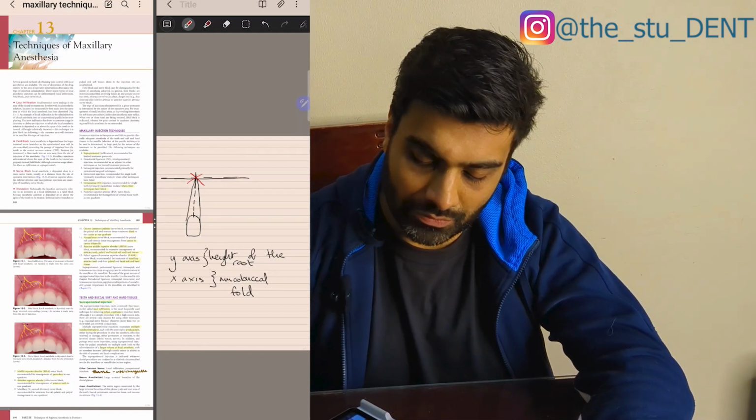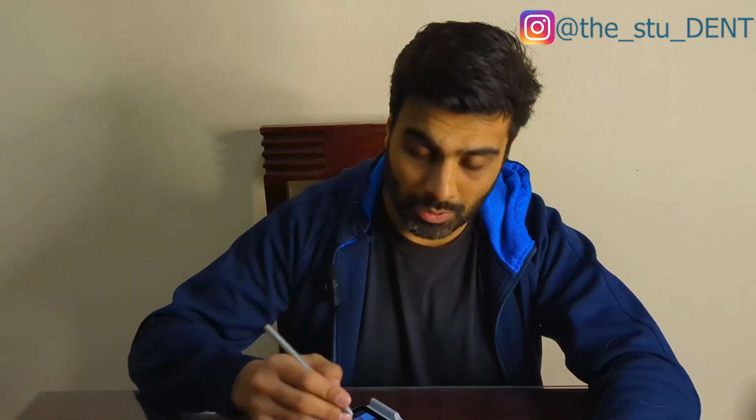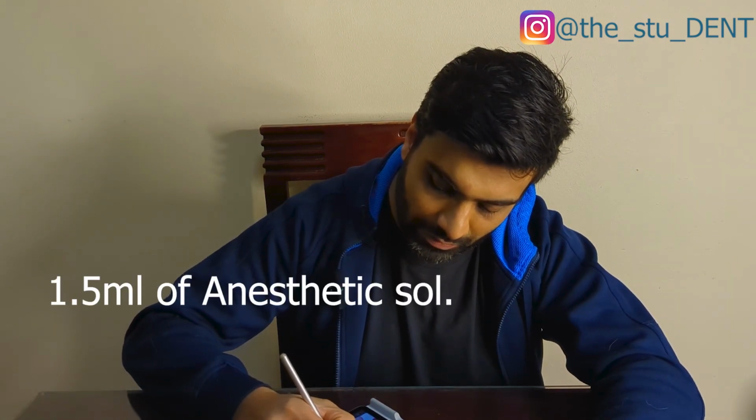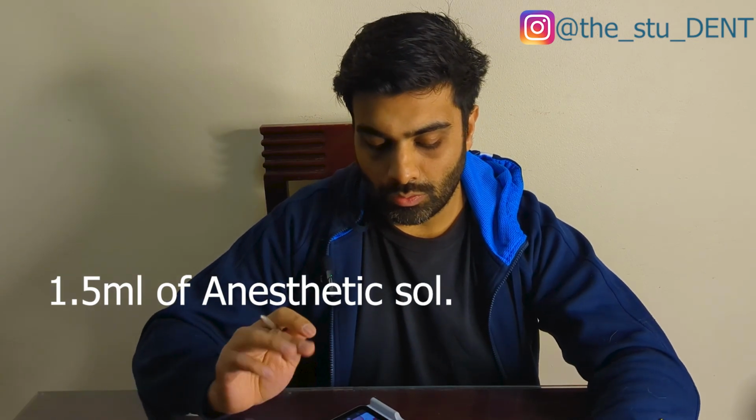Now, typically for infiltrations on the mucobuccal side of things, or the buccal side of things, labial, the outer facing side of the teeth, we want to be hitting around 1.5 milliliters there of the solution. Now, what will help us later on is knowing how much we've got left. Now, in a typical 1.8 milliliter cartridge, we're going to end up with 0.3 remaining. And that's going to be a very important number for us to remember for the palatal side of things, which we're going to come on to now.